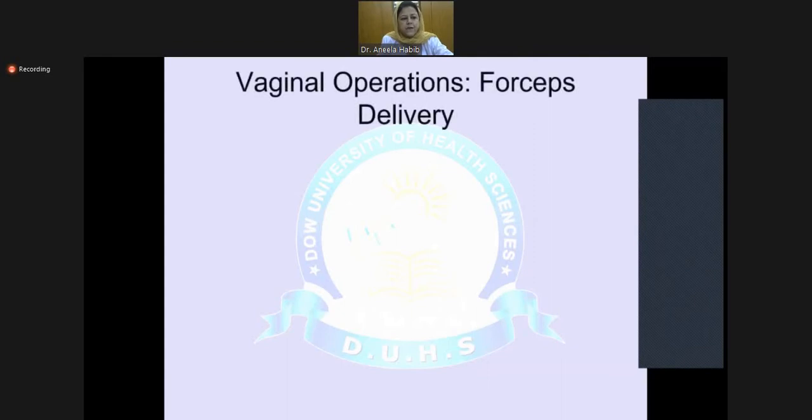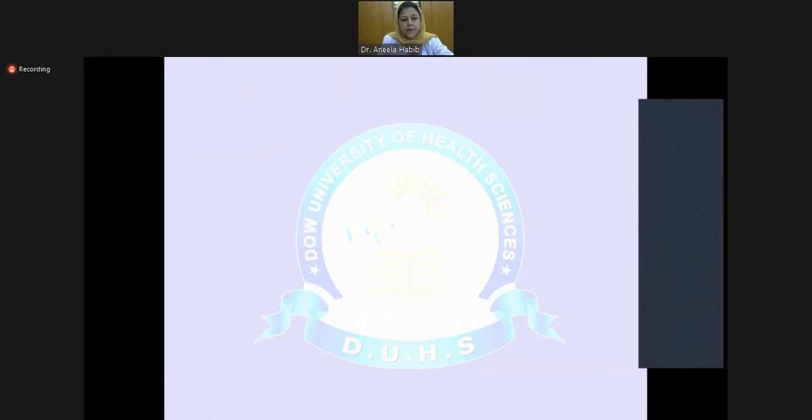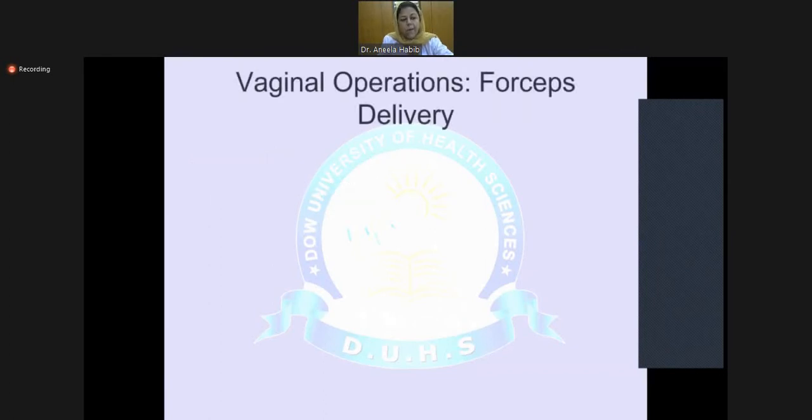In any vaginal instrumental delivery or obstetrical surgery, you have to have expertise in your hand. Unless you are expert in the application of that particular instrument, you may hurt the patient, you may damage the baby or the nerves of the baby. So you must have a proper expert person who is going to apply that.